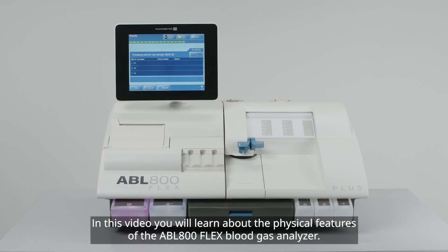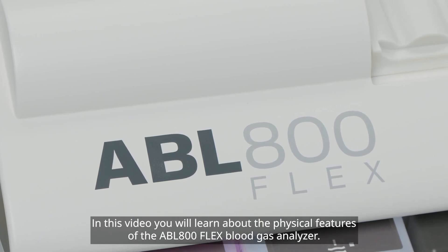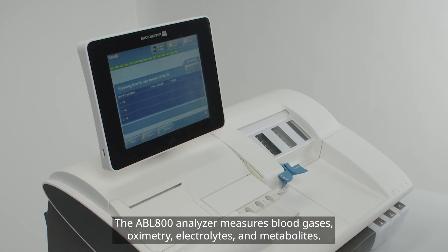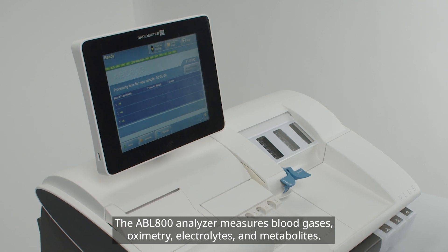In this video, you will learn about the physical features of the ABL 800 FLEX blood gas analyzer. The ABL 800 analyzer measures blood gases, oximetry, electrolytes, and metabolites.